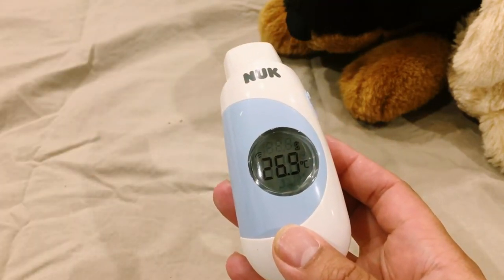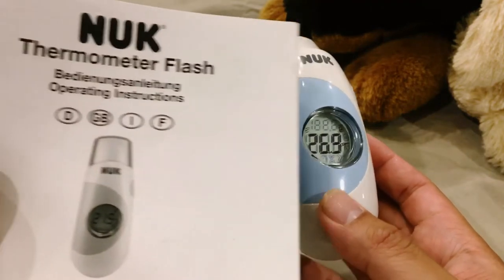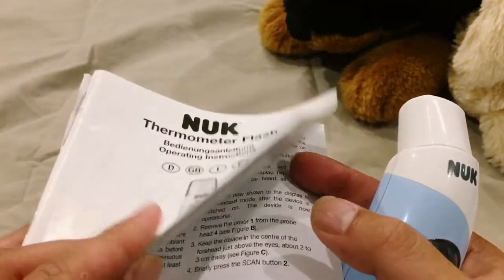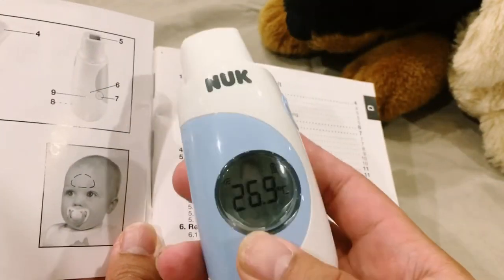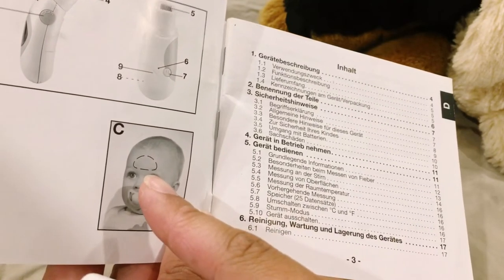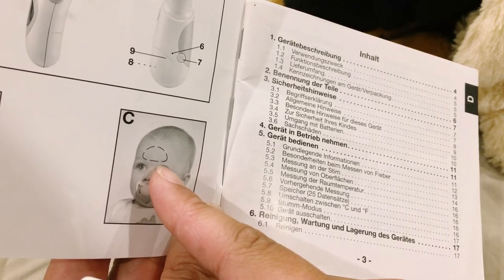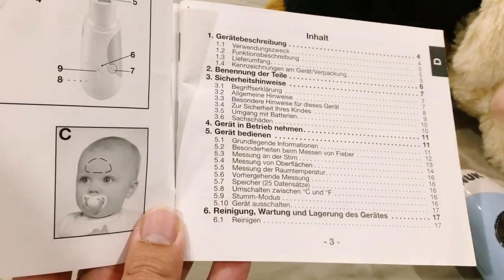Now there are a few things you need to do to ensure the accuracy of the reading. The first thing is to hold the sensor of the thermometer as close as possible to the surface of the object to be measured. Secondly, when measuring body temperature, point the sensor in the center of the forehead just above the eyes, about 2 to 3 centimeters away.